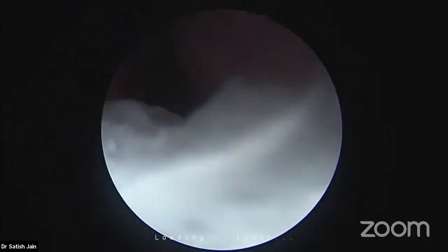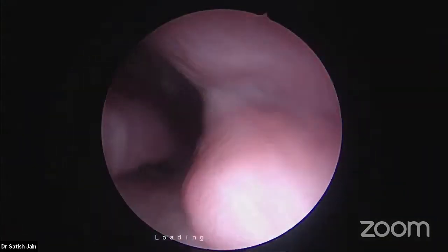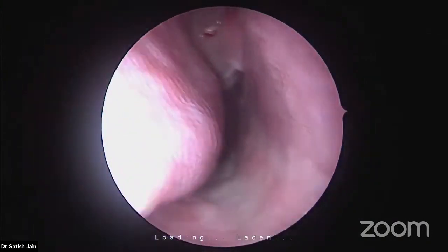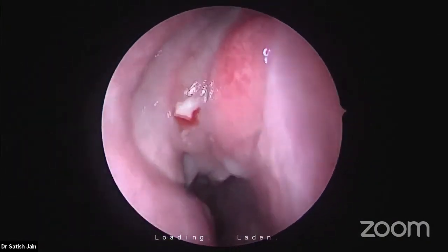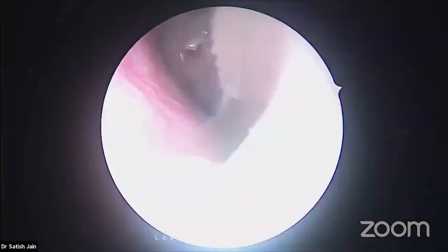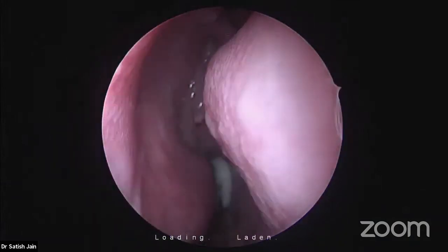In this surgery, the main source of bleeding is capillary, not arterial like tumors such as angiofibromas. It is always the capillary bleeding which needs to be controlled, which is responsible for the good surgical field, responsible for the bleeding.